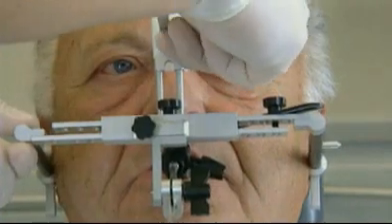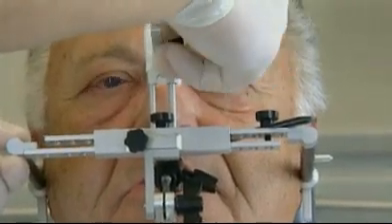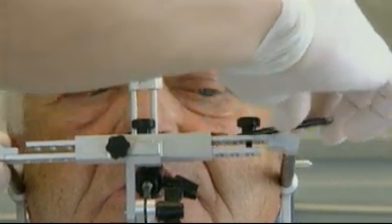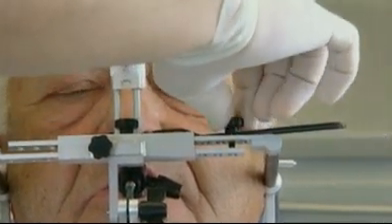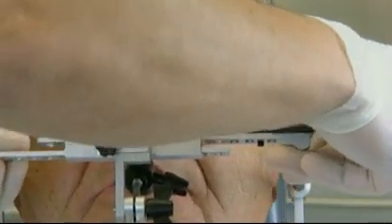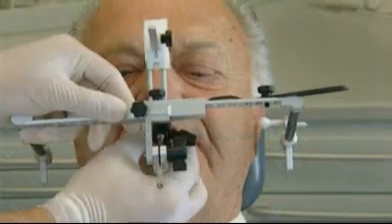Subsequently, loosen the locking screw from the side arms and the nosepiece. Pull the lateral arms apart and remove the appliance from the patient.